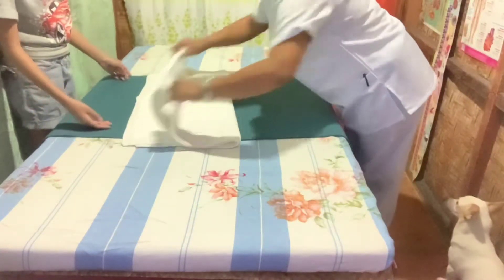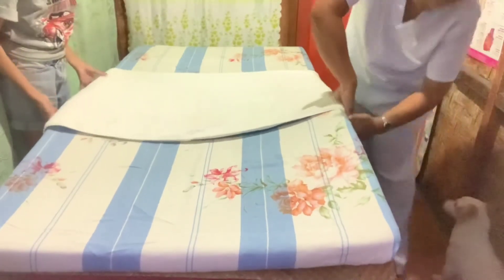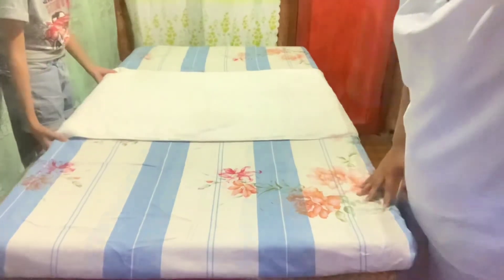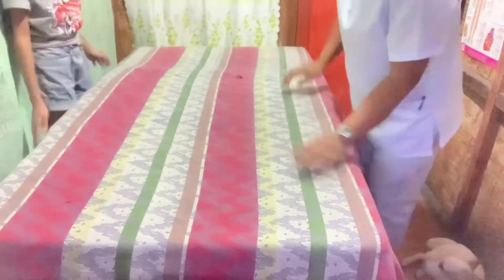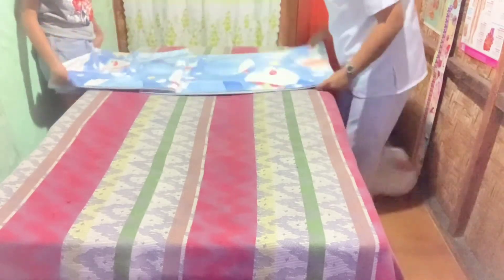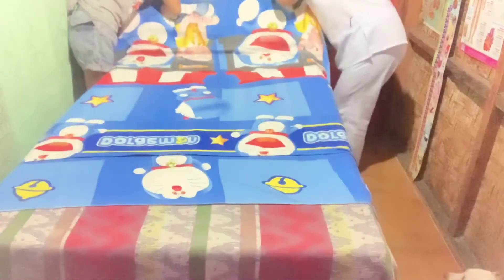Place the cloth draw sheet over the plastic draw sheet, making sure the plastic draw sheet is completely covered, then tuck the near edge smoothly under the mattress. Place the top sheet on the bed with the center fold at the center, seam side up, and unfold it toward the far side. Place the blanket on the bed with the center fold at the center so that the edge of the blanket is about six inches from the top of the mattress, then tuck in the bottom of the blanket together with the bottom of the top sheet.